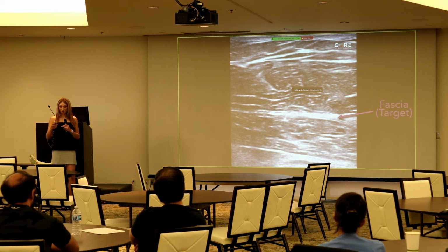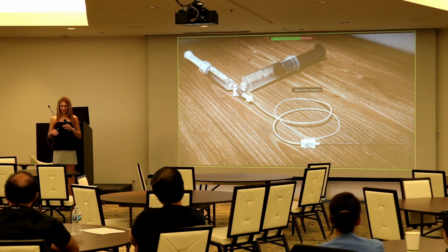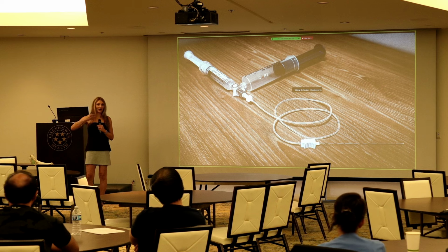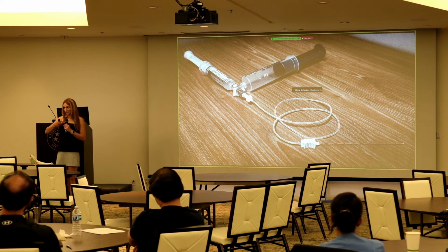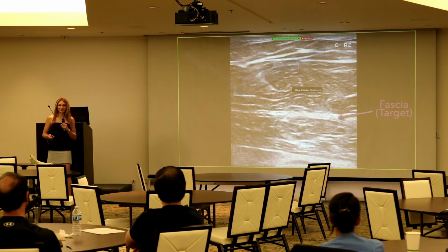But it is a 2-person technique, right? You can't hold the probe, hold the needle, and hold the syringe at the same time. Always check with whatever institution you're in, but where I'm at, I grab a nurse to help push the anesthetic because they can push drugs, right? I'm holding the needle, and I will just say, give me a very small squirt, a little bit more, a little less, aspirate. So I'm just telling the other provider what to do. You don't necessarily need 2 physicians to do that. You don't need an MD or a DO degree to aspirate and push an injection with another provider there. That's my opinion, but local guidelines, right?